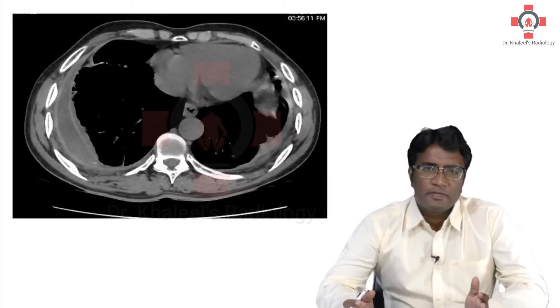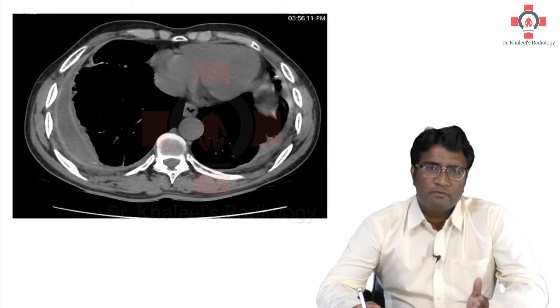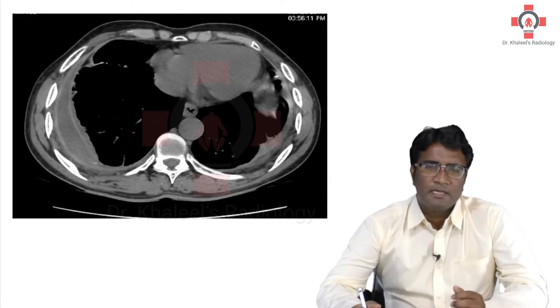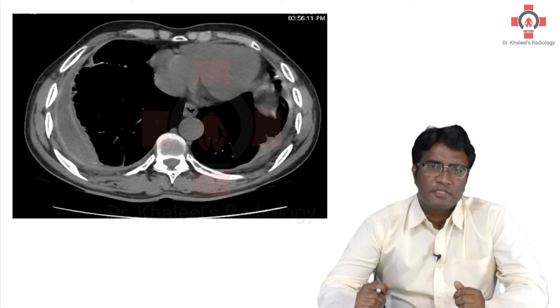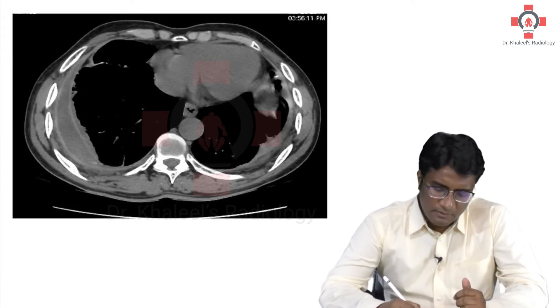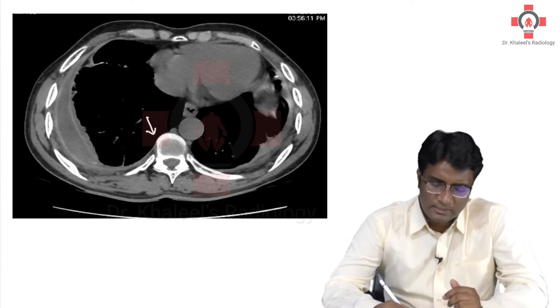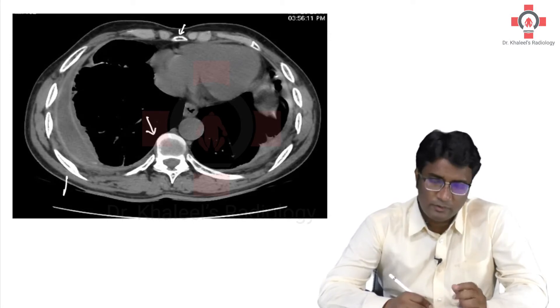Now, please look at this image. In this image, what do you think is the diagnosis? Do you think it is right pleural effusion, left pleural effusion, right empyema, or left empyema? Let us look into this image carefully again. The vertebral bodies are white, you can see the sternum, the ribs are also white — so we know this is a CT scan.